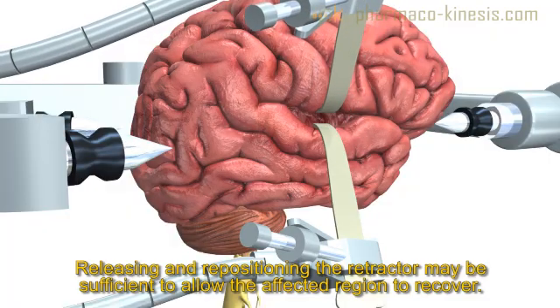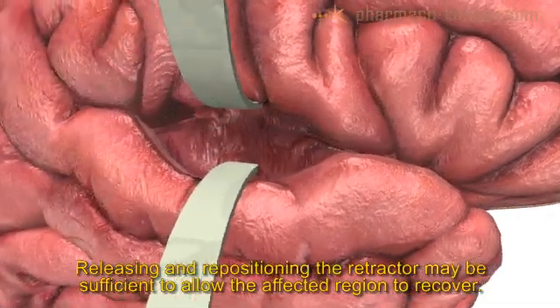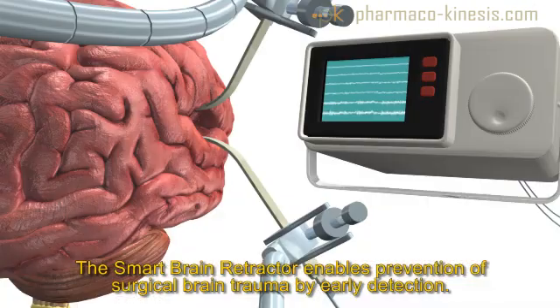The retractor blade is then simply repositioned to allow the subjected tissue to recover. An alert can automatically activate an auxiliary system, such as a drug infusion pump, to stabilize the patient. The Smart Brain Retractor offers predictive detection of trauma associated with surgical brain retraction and improves the quality of treatment for patients undergoing brain surgeries.